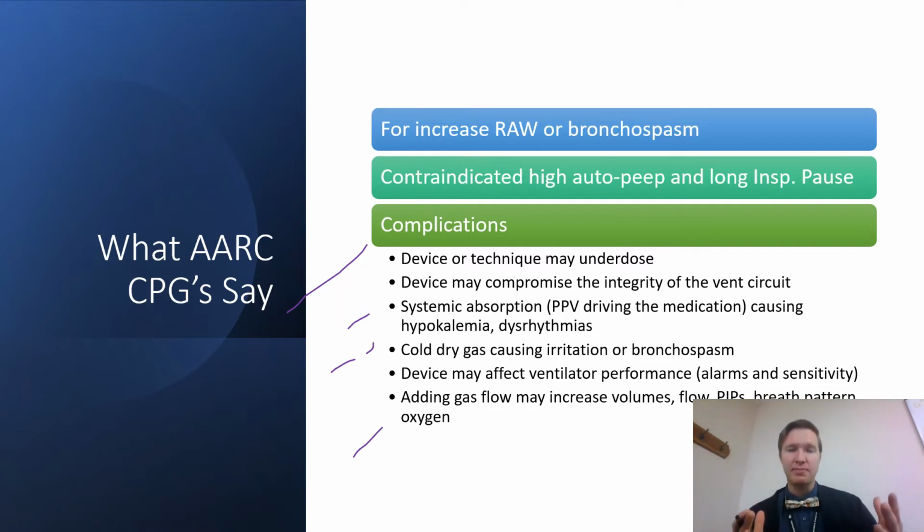Where are we at with this patient with doing a bronchodilator? Are they sensitive to cold, dry gas, right? Is there something else we can do where we don't have to do that? Maybe that's a switch to an MDI. Right? Maybe we're doing something like a vibrating mesh nebulizer where we run it through the heated circuit and we don't have to worry about the cold, dry gas, right?